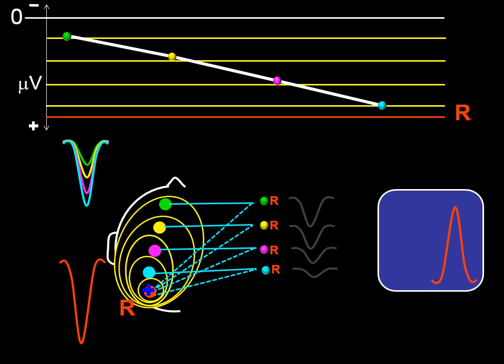Being that the activity going into the differential amplifier through input 2 gets inverted, and that this activity is maximal, it stands to reason that the polarity coming out of the differential amplifier will be ruled by the amplitude of the wave from the reference.